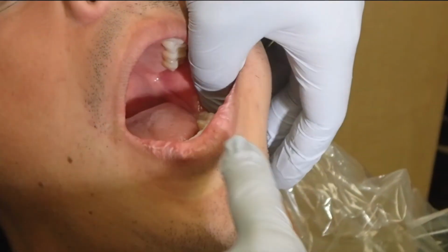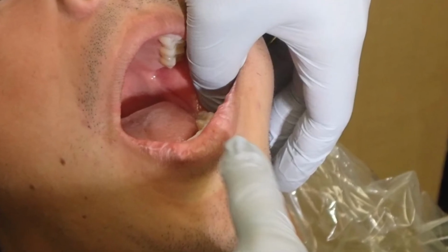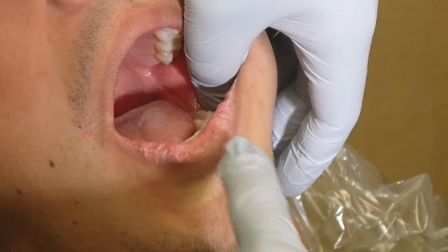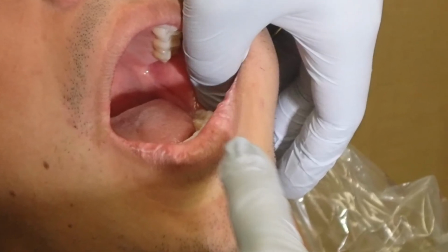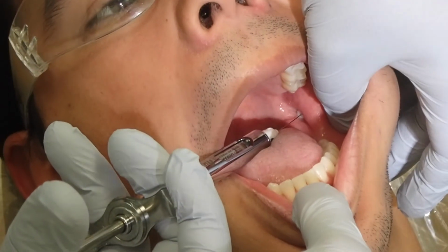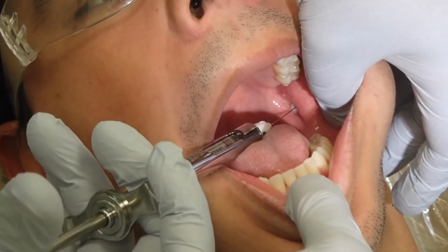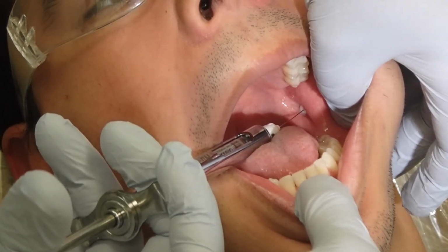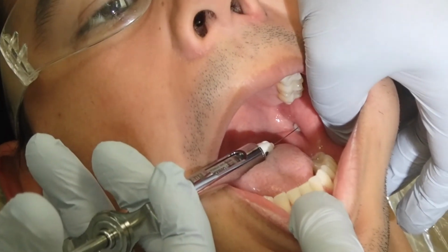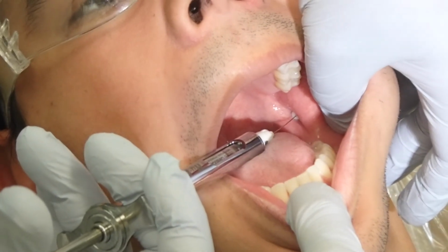One technique for administering the IA is to rest the thumb of your non-dominant hand against the ascending ramus. The middle and ring fingers of the same hand should rest against the angle of the mandible on the outside of the patient's mouth. Approach the insertion site from the direction of the contralateral mandibular first and second premolars. The insertion site should be at or slightly above the mandibular plane of occlusion. Take care not to penetrate the pterygomandibular raphe during insertion.